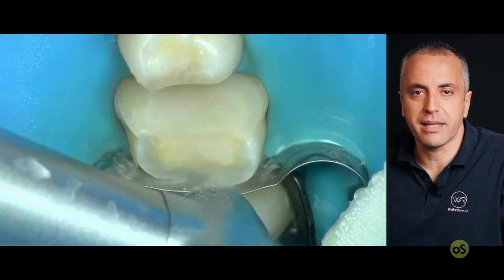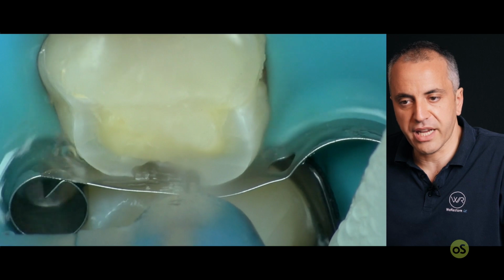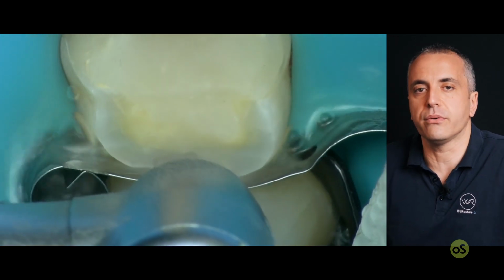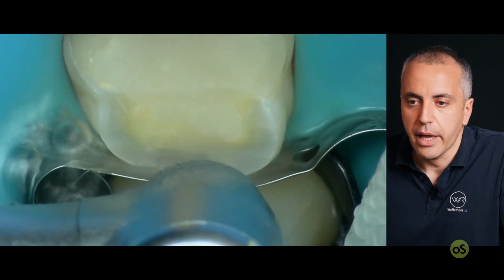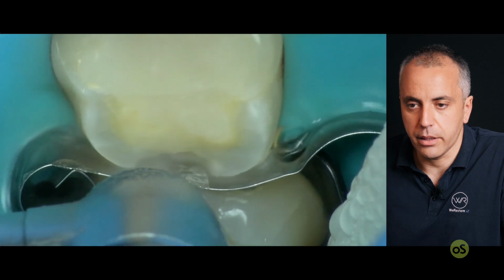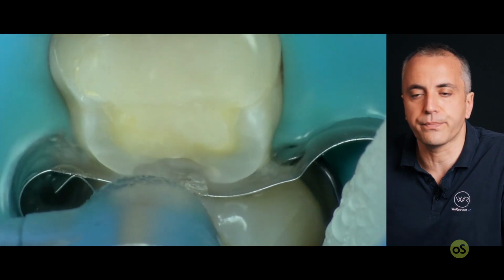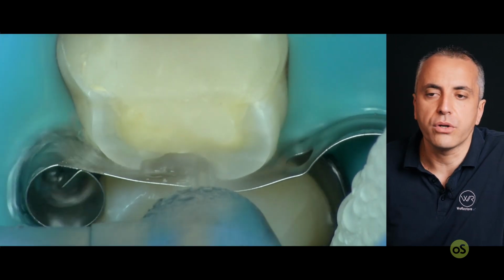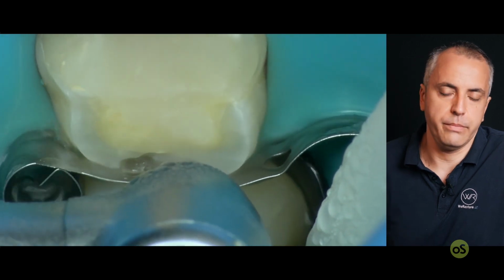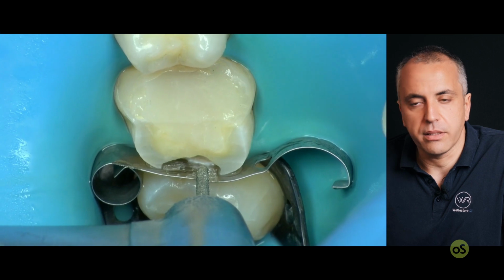It takes time. It has to take time because we don't want to prepare too much. We don't want to go too deep inside because otherwise it will be very difficult to restore. And we need the proper amount of time to prepare the correct box. Of course, as soon as we can, we can move to a bigger diameter in order to make things quicker. This is the big diameter.